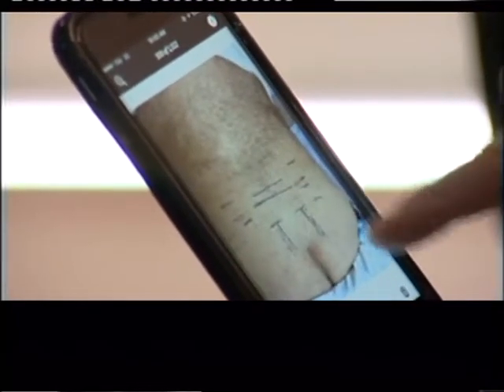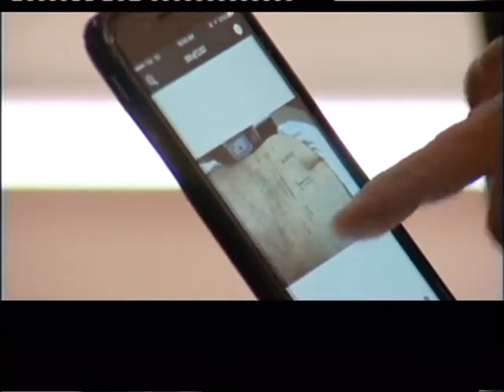Doing the front, back. Those are all patients. I always do it. You always sign the patient before needling? Yes, always. Just everyone.